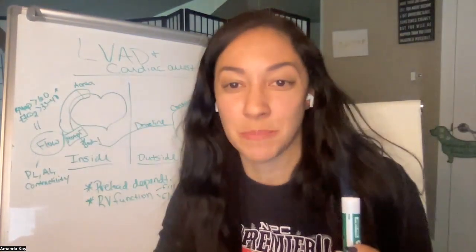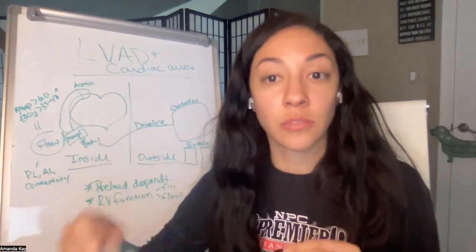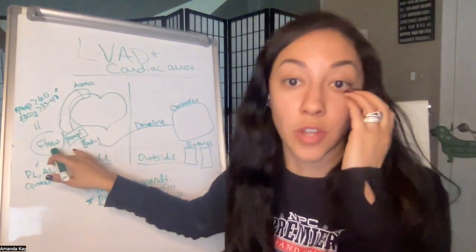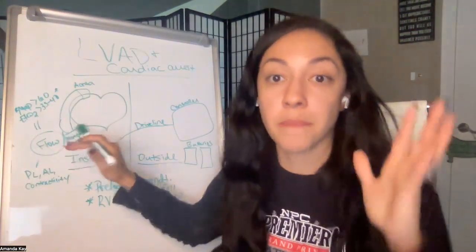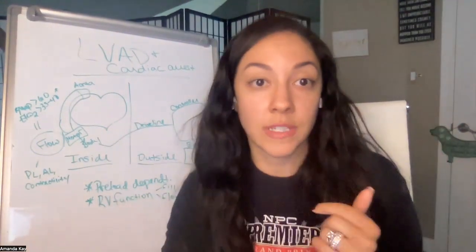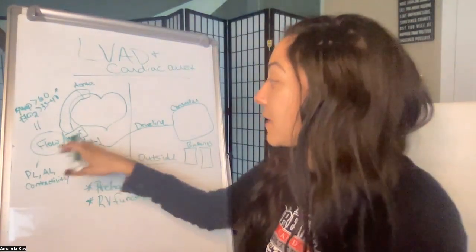In the body, that's connected to a motor turning an impeller, rotating at a high speed, which basically moves blood forward. This is going to be your flow, which is crucial to know. So this is the motor or pump that generates flow, and it's set via the team. You've got pump speed per minute, which is usually set by the VAD team before you even see this thing. That's pumping out to the body, that's your flow.